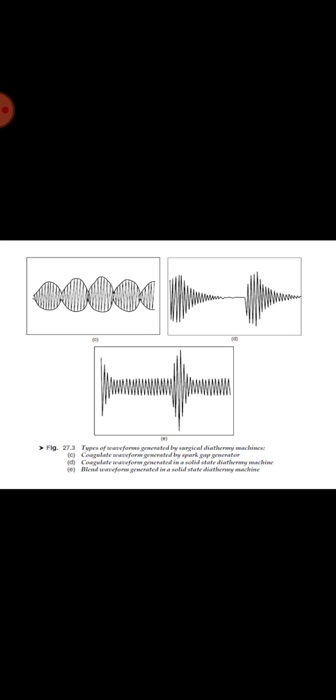The use of high frequency current offers a number of important advantages. The separation of tissues by electric current always takes place immediately in front of the cutting edge and is not caused by it. Electric cutting therefore doesn't require any application of force. Instead, it facilitates elegant and effortless surgery. The electrode virtually mills through the tissue instantaneously and seals the capillary and other vessels, thus preventing contamination by bacteria. A simplified method of coagulation saves valuable time, since bleeding can be arrested immediately by touching the spot briefly with the coagulation electrode.